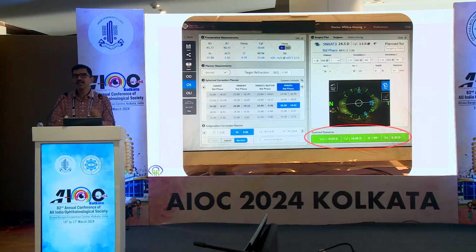And believe me, if you're not giving the services of a toric IOL to a patient who needs that, and just depending on the spherical equivalence you're putting in a monofocal non-toric IOL, this is what the patient is going to land up in, and the quality of vision is something that the patient would never ever be happy with.